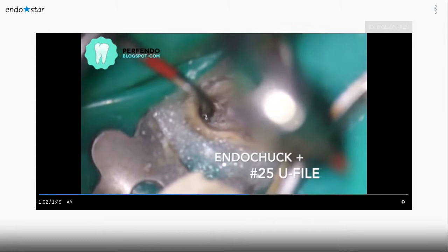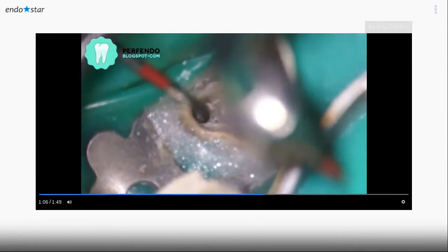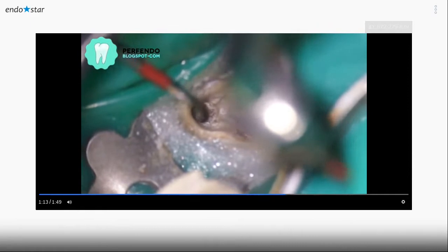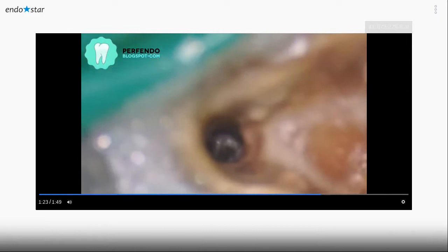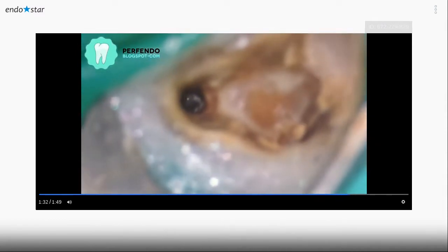Now I'm continuously applying ultrasonic forces to the file and doing some rotary movement with the tip while working. And in a second you can see it just disappeared. It disappeared because my dental surgery assistant was continuously blowing air into the operating area, and when the file jumped out, it was blown out of the pulp chamber and went directly to the suction.